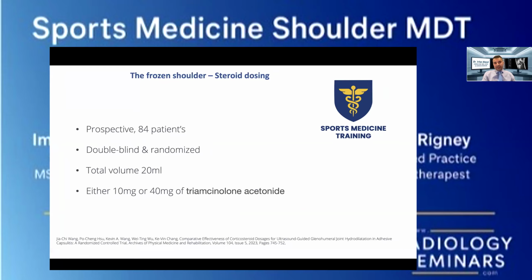So this is one of the studies that we come across in the frozen shoulder module. I think it's quite clear that this patient has a few pathologies going on. It looks like from the clinical history, although brief, that the restriction was the main problem with the patient. And we really need to understand how we can unfreeze that shoulder and get them going.